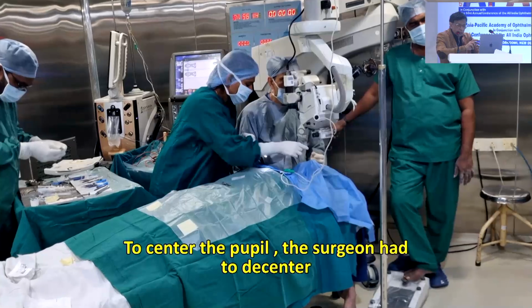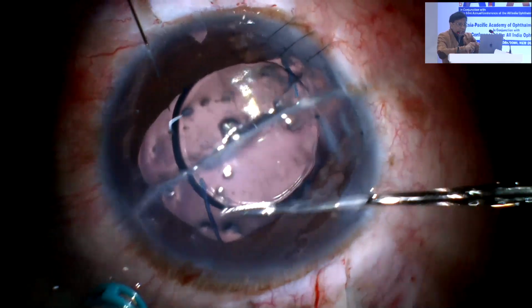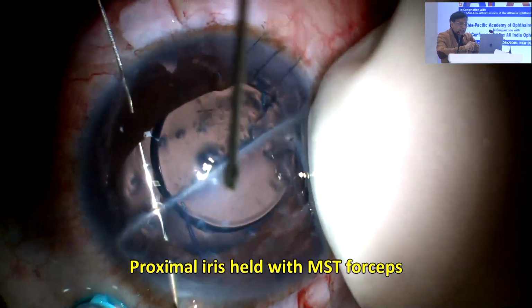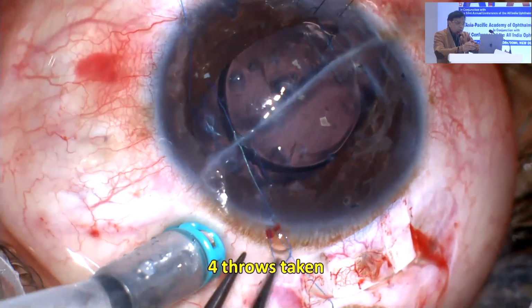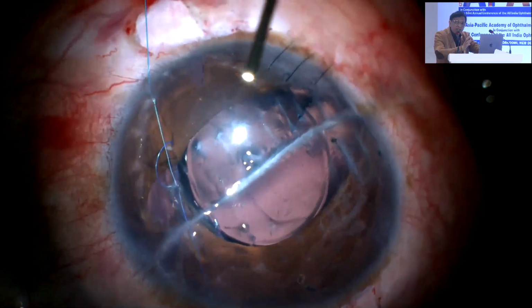So now you see I'm just going to rotate the trolley of the patient so that I can be comfortable. Now look, I'm going to start the single pass four-throw pupilloplasty. The advantage of the four-throw game is it's very easy. You can keep on repeating it as many times as you want. But the idea is simple. I need to make a 1.5 millimeter pupil.